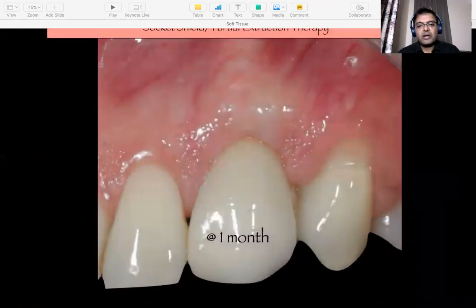And that's what you want, a fabulous outcome without doing any intervention. You see a beautiful stippling around this tooth, and this outcome is going to last the life of this particular patient, or as long as that particular implant is in function. And that's why not doing anything is the best thing that you can do to your patient to get the best soft tissue outcome.